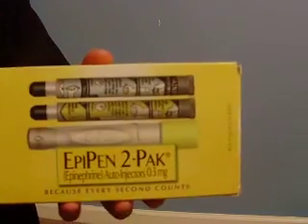Hi guys. Today I'm going to show you how to use an EpiPen epinephrine auto-injector. An EpiPen is an injector shot used to administer medication to a person who is having an allergic reaction or is in anaphylactic shock due to coming in contact with something they're allergic to.